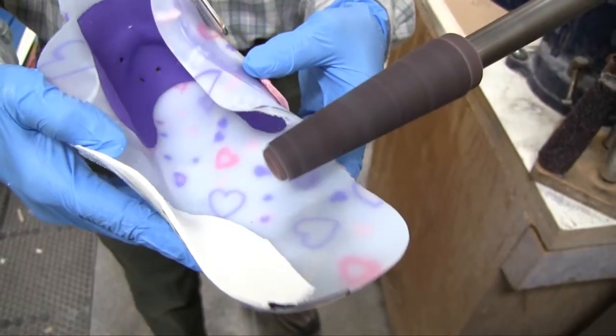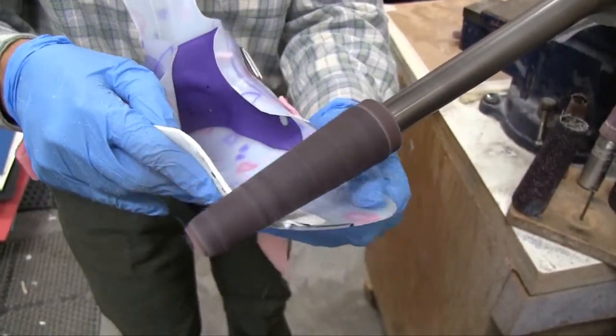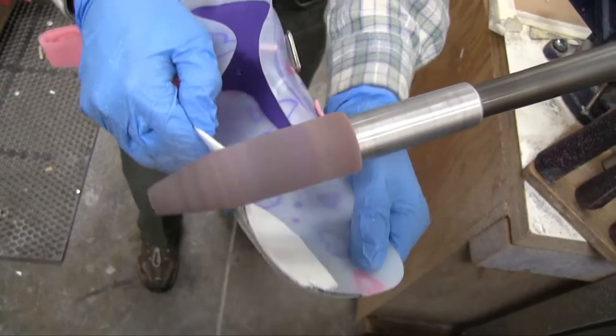I went ahead and took this back into the lab. I use a Troutman router with a heavy duty grit to do the initial grinding, and then I'll use a buffing cone to actually smooth the edges for that nice smooth finish.